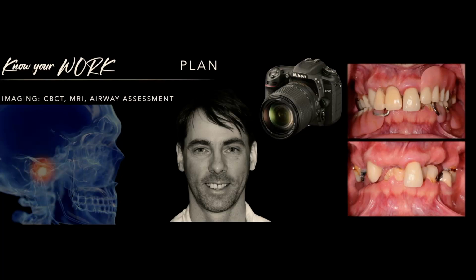So, knowing your work is getting a plan, getting all the information for your plan. We do a lot of digital photography, as you can see. As we talked about this morning, it may be really important to get a CBCT, an MRI, and airway assessment for these patients, because if we can't predict where the joint space is, where that joint capsule is, what he's going to do at nighttime when he's sleeping, that will all affect our treatment.